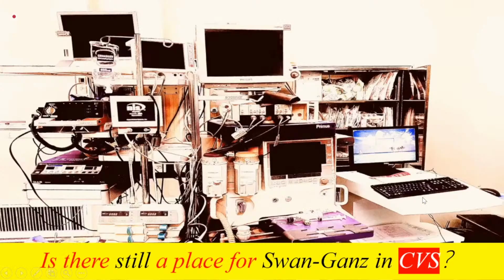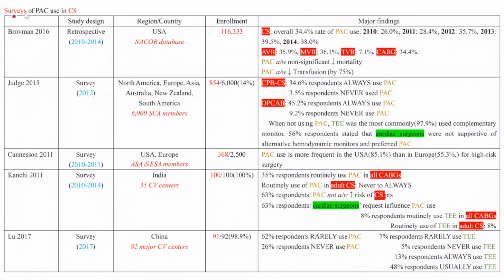Is there still a place for the Swan-Ganz catheter in cardiovascular surgery? I also summarized the surveys and the retrospective studies of PAC use in cardiac surgical patients. For example, according to Brovman 2016, the overall PAC use in cardiac surgical patients in the United States is around 34%, and showed an increase from 2010 to 2014.